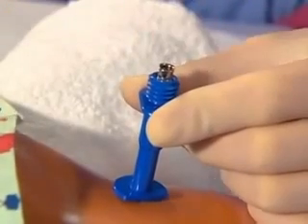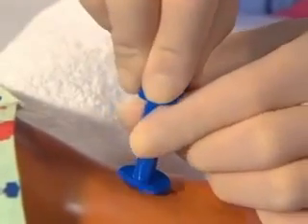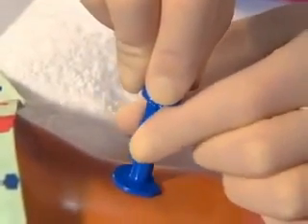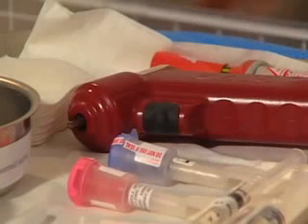If the device has a supporting flange, adjust it so the surface is flush with the skin to stabilize the needle and to avoid inadvertent deeper insertion. Take care to avoid disrupting the needle while adjusting the flange. For power-assisted insertion, we will demonstrate use of the drill device.